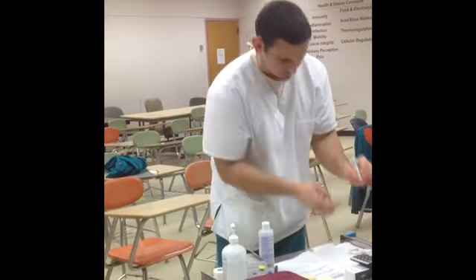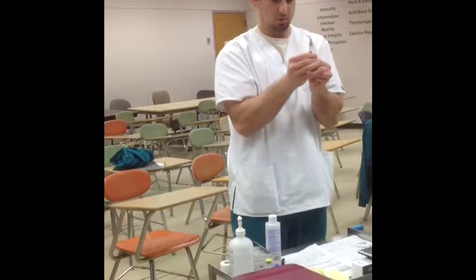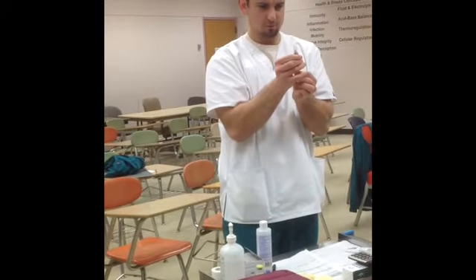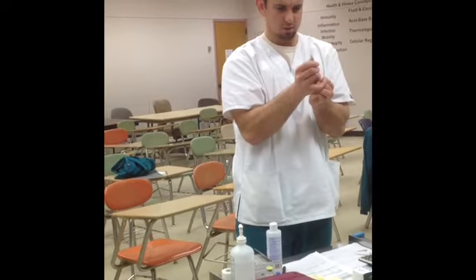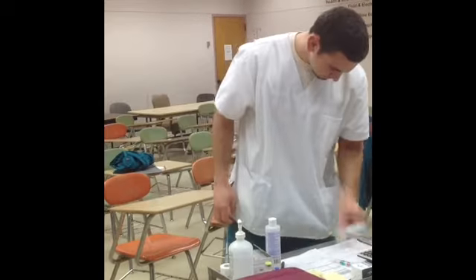It's already drawn up, so now I just want to lift the cover on the needle so I don't accidentally poke myself. Okay, now all my materials are set up.